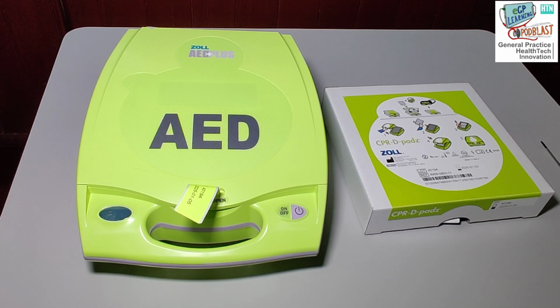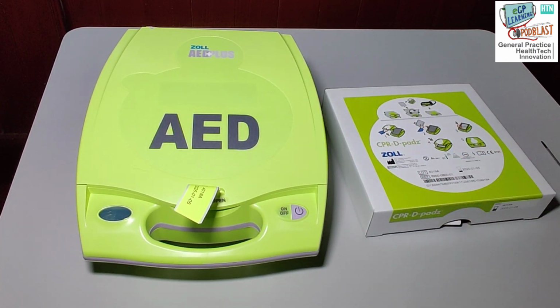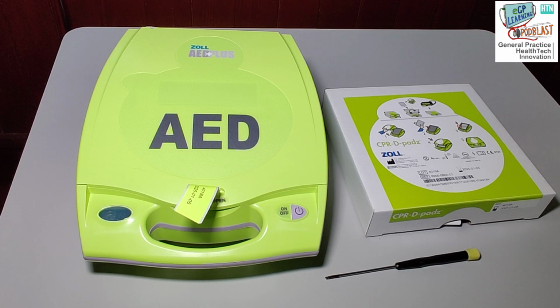When you unwrap the package you'll have something that looks fairly similar to this. In order to set up the device you'll obviously need the device itself, the pads, the battery packs which I have already installed, as well as a screwdriver. In terms of installing the device, the first thing I would recommend is that you put the batteries in first.